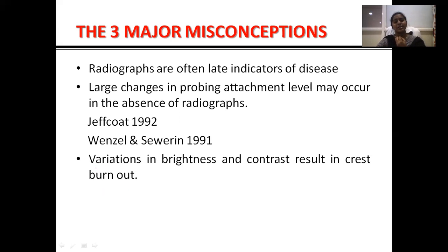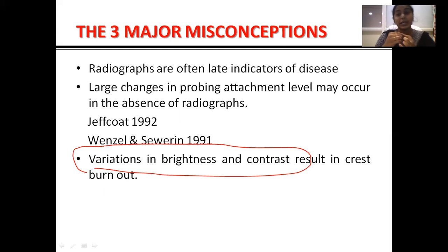And we also say that variations in brightness and contrast result in crest burnout. So this is with the processing difficulties. In case of digital intraoral radiography, we don't have the processing difficulties, right? Digital intraoral radiography avoids the processing difficulties and we can easily adjust the contrast and brightness of the pictures. We can zoom in and zoom out. We can easily appreciate the changes that are shown on radiographs.